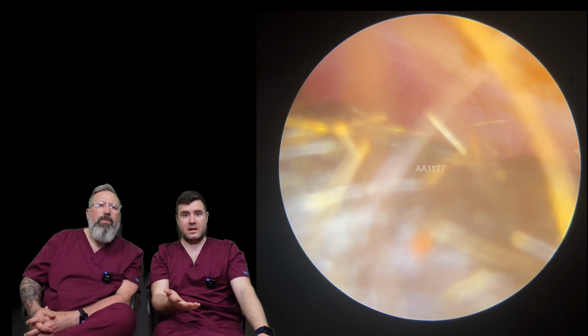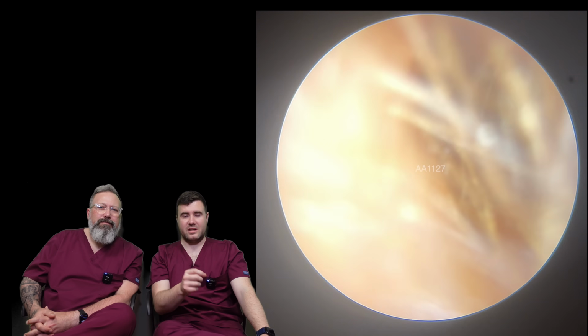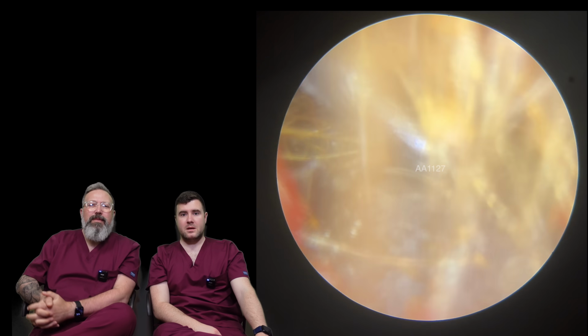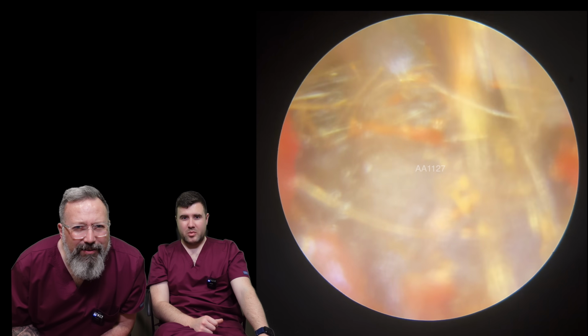There we are. You can see there's a little bit of a gap there now. That's the Rai Curette. This is a slightly smaller sort of hook on the end now. Tapers, doesn't it? A little bit easier to get into these little smaller sort of nooks and crannies. So I'm just going to pop this in.